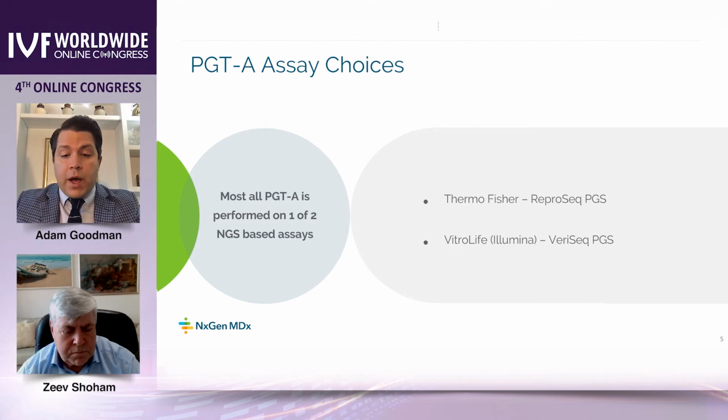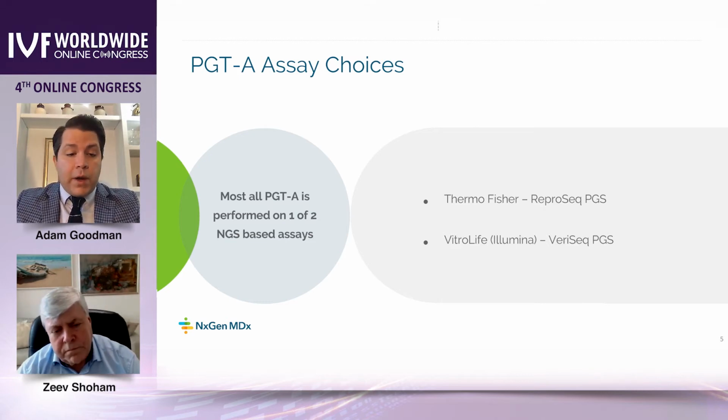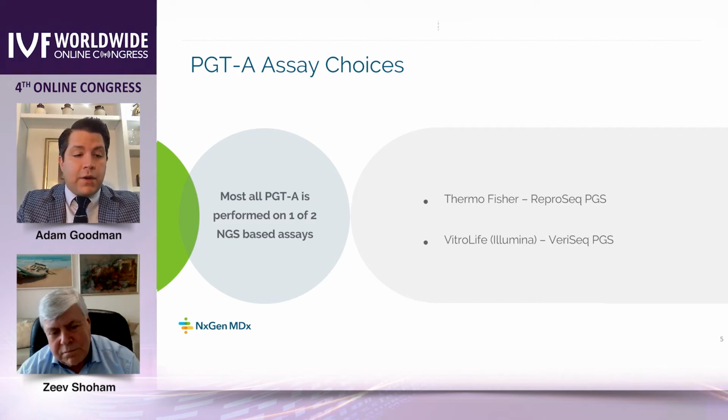Therefore, all third-party options that I have explored have been cost prohibitive, as no matter how low the cost of their library prep reagents, one must still purchase the sequencing reagents from Thermo Fisher or Illumina. In my experience, this kind of three-party arrangement is only financially feasible if resolution is severely sacrificed.